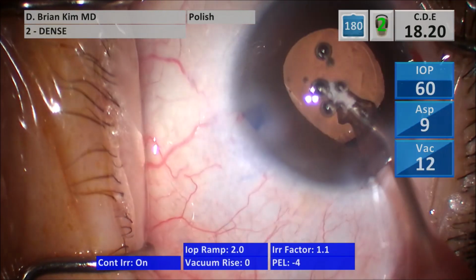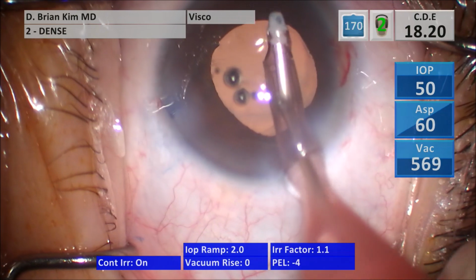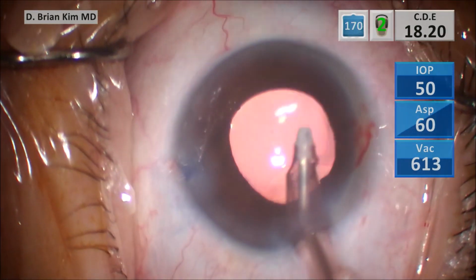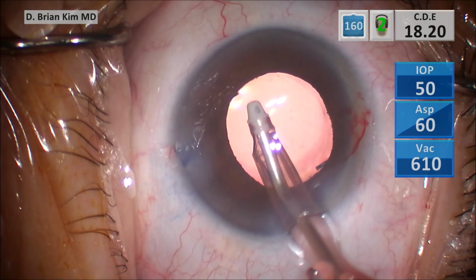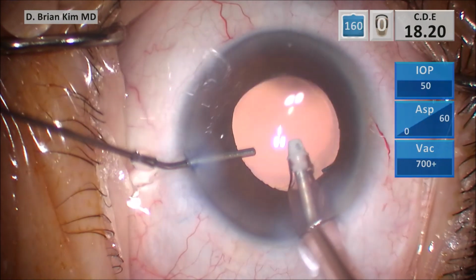Now I switch to visco mode, and now I'm removing all the viscoelastic in the anterior chamber, as well as the viscoelastic that's coating the corneal endothelium, and lo and behold, all those bubbles are gone now. And so now all the viscoelastic is gone. Now I'm actually removing the viscoelastic from the corneal endothelium because I don't need it anymore. But that means the corneal endothelium has been protected the entire time.